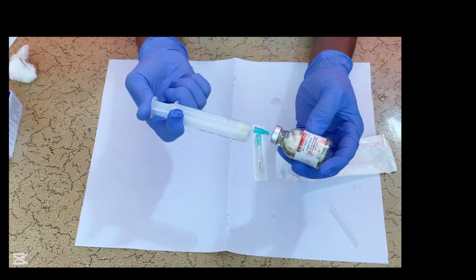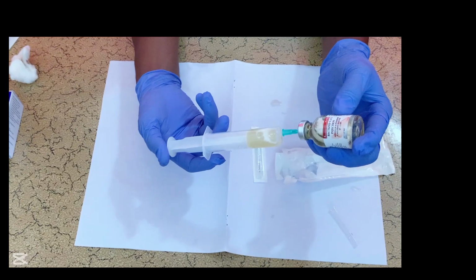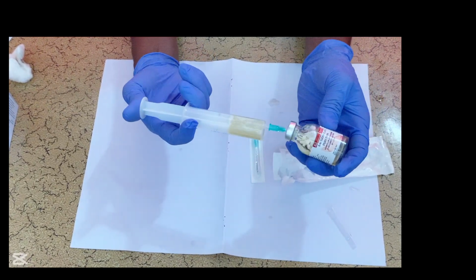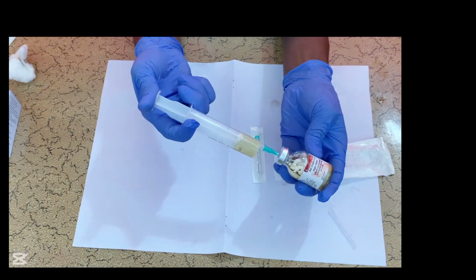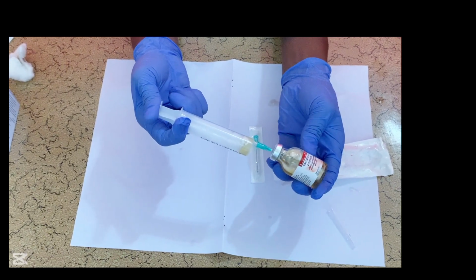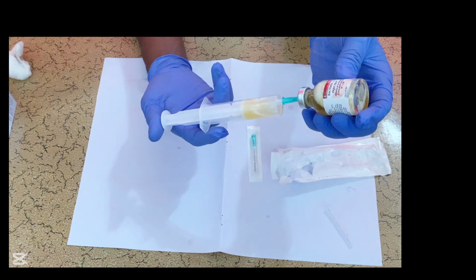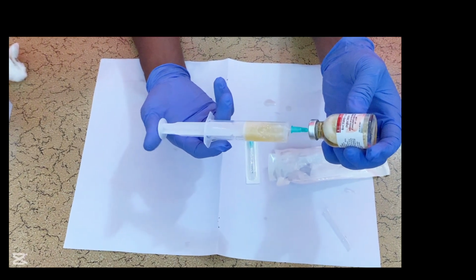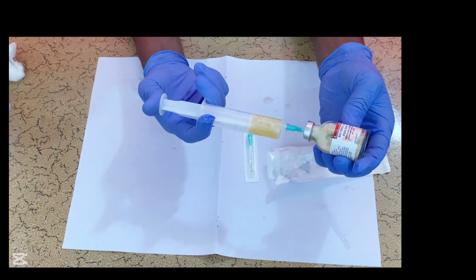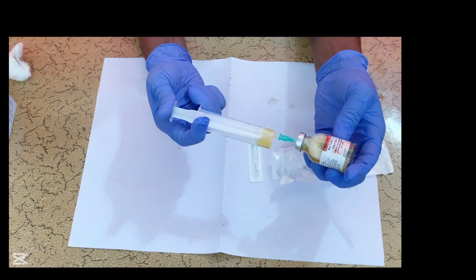Then you release to allow air bubble into the syringe. Then again you squeeze it, you push it gently. Then again you allow air bubble into the syringe. Then again you gently push the plunger to reconstitute the drug.